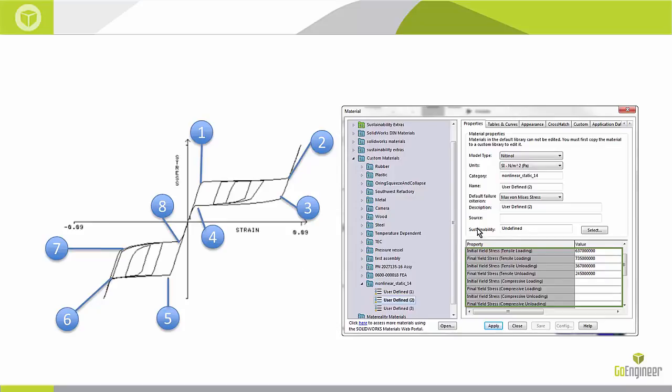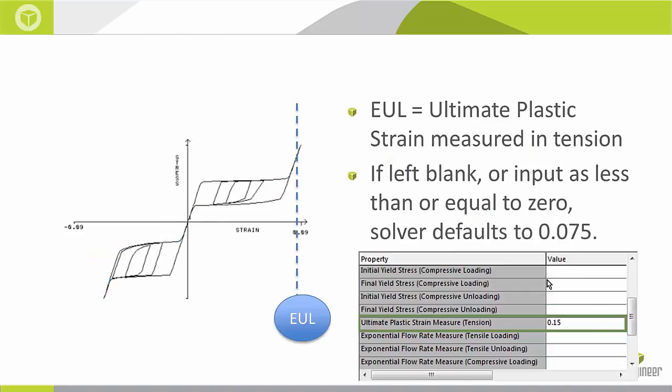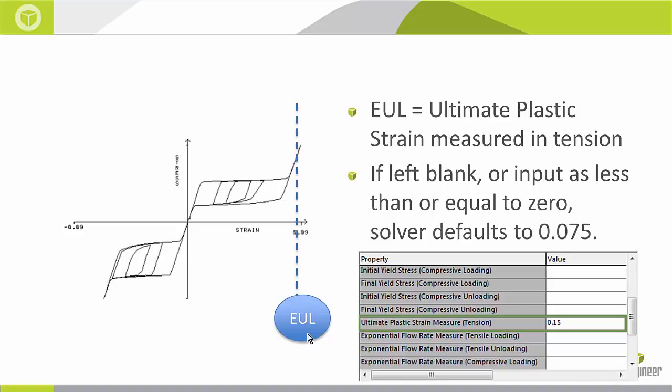However the picture I have over here only has data for tensile loading. This is technically okay in this particular scenario. As long as I'm applying tensile loading on my CAD model the simulation will load just fine. If I scroll down further in this menu I would get to this other property the ultimate plastic strain measure in tension in parentheses, and this is just the ultimate plastic strain measured in tension. It's commonly notated EUL which is just the area of the stress strain curve where the metal is likely to break.